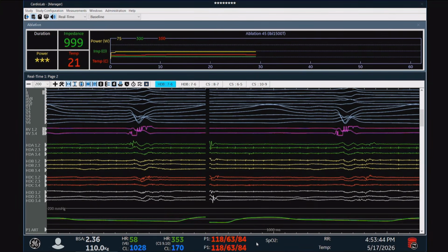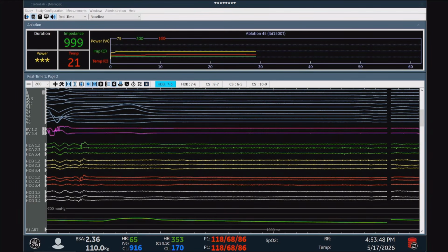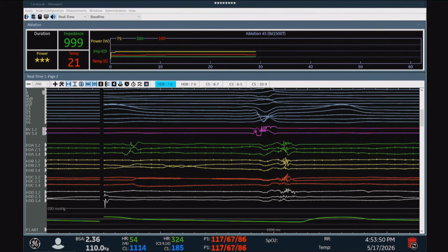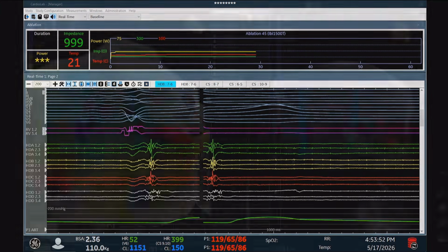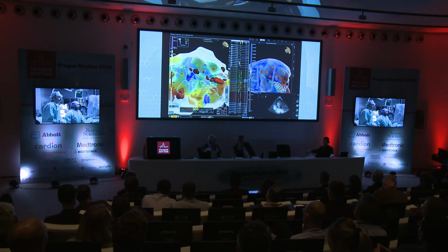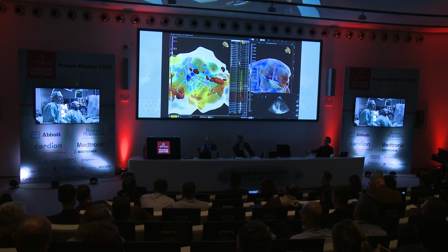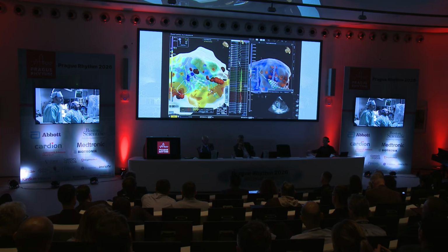I think you have a clean case. It's an extensive scar, and I think close to the papillary. We're gonna say last 10 minutes for you. We're gonna let you work because, based on your predefined lesion set, you have a lot of work still to do. So maybe we leave you at rest. You do your best, and then we come back to you, and we're gonna say last 10 minutes definitely for your case because it's most complex. It's a young guy, and do your job.